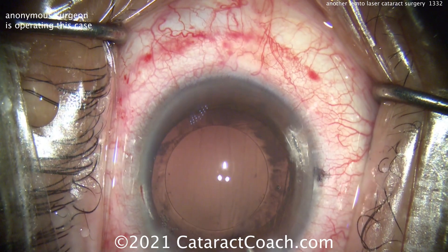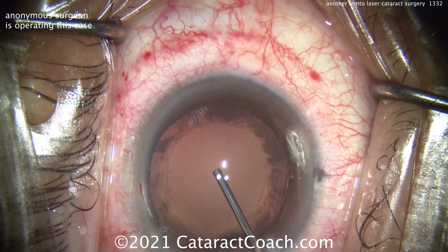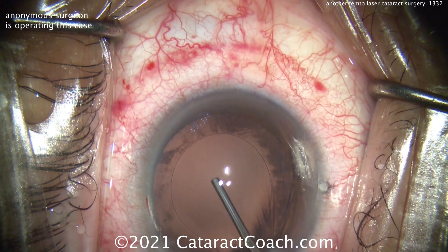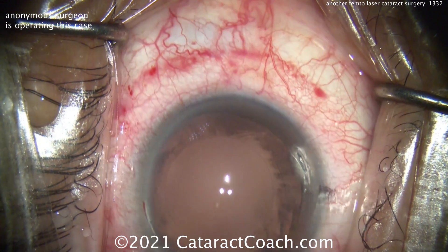Injecting some viscoelastic — inflating the capsule bag, probably a cohesive viscoelastic. That looks great. Nice, good, solid fill. And a little bit more.